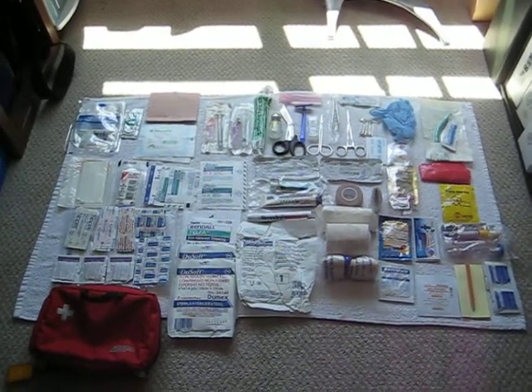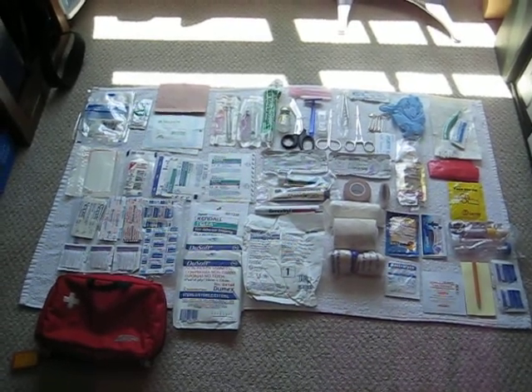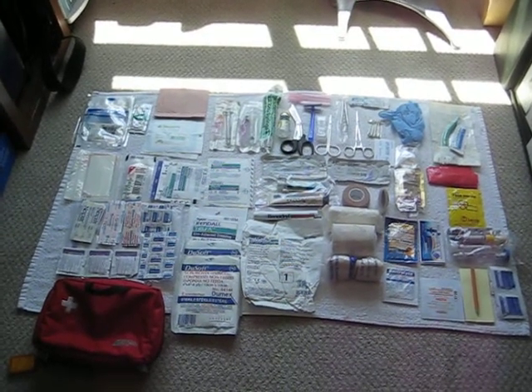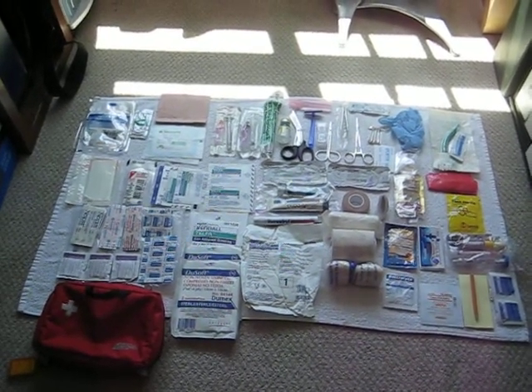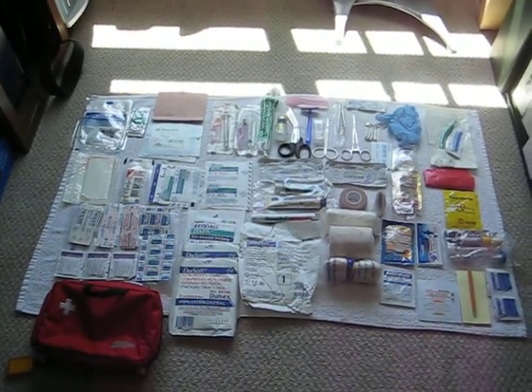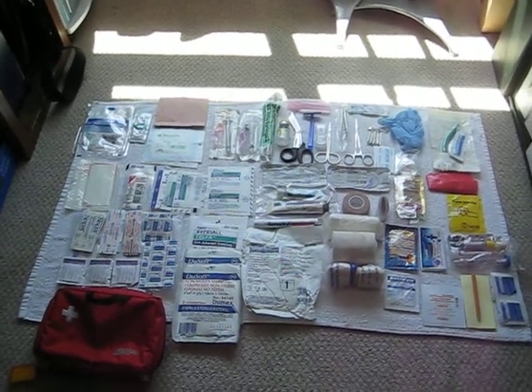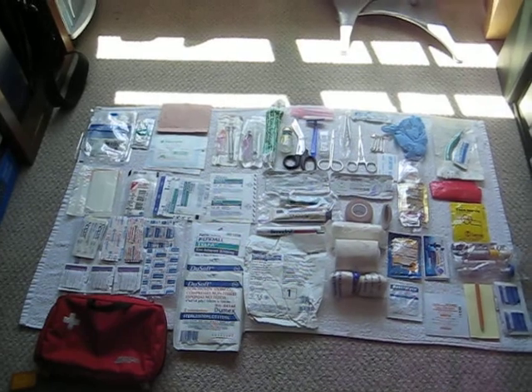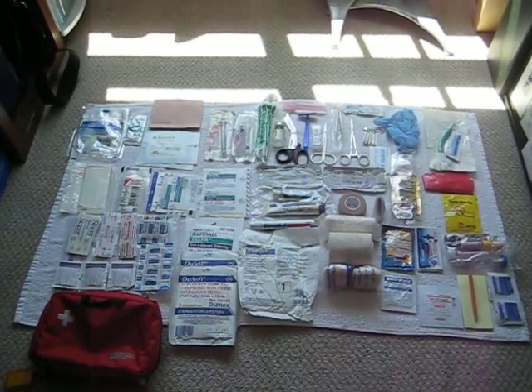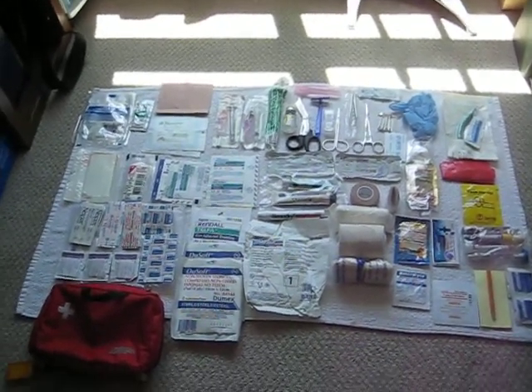YouTube paramedic here, showing you guys my ultralight medical pack for backpacking and multi-day ski touring. It's designed to facilitate any kind of injury you encounter in the backcountry. I operate at paramedic level. Some of this stuff is outside of my realm of care, but I keep it in here for worst case scenarios, being multiple days away from care. So yeah, we'll show you guys step by step what I got.